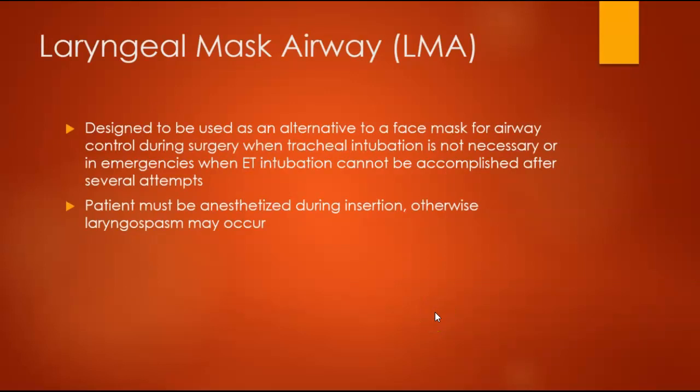These are designed to be used as an alternative to face mask, and typically used during surgery when actual tracheal intubation is not necessary. Also, we use these in emergency when you can't get the patient intubated after several attempts. Again, intubation, when we get to that, requires a skilled provider to do that. As you practice in lab, you're going to realize how dang hard it is to intubate a patient. So using laryngeal mask airways is a great alternative.